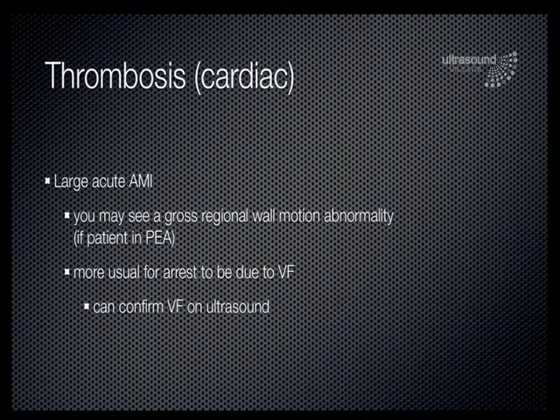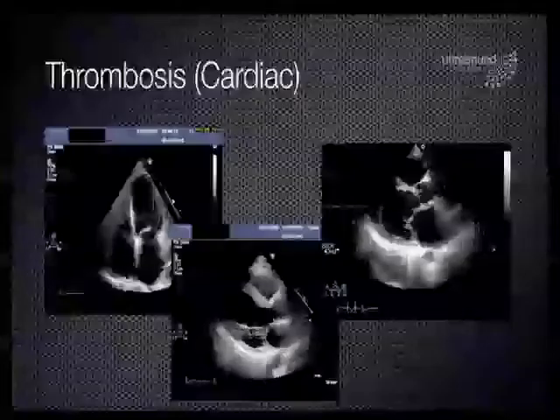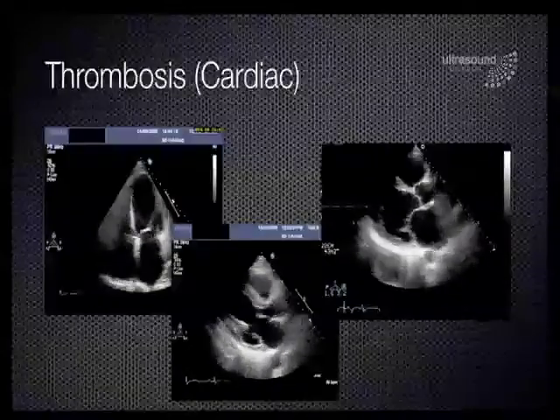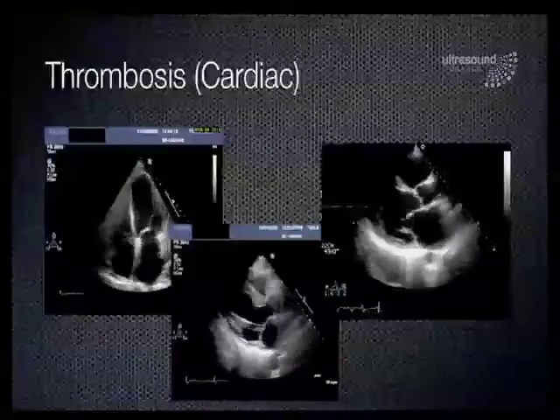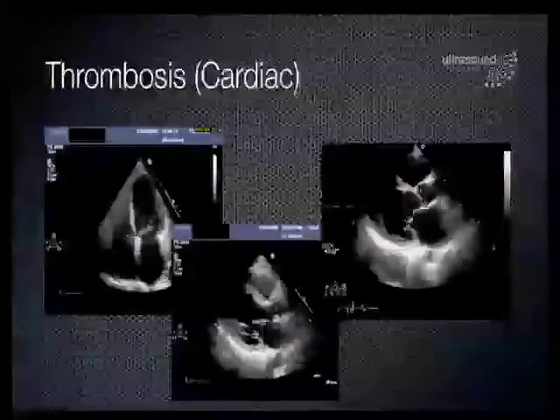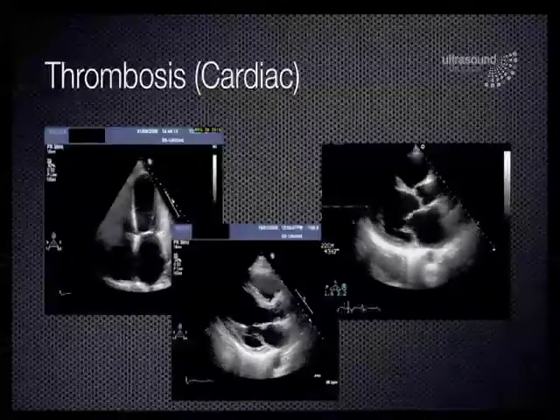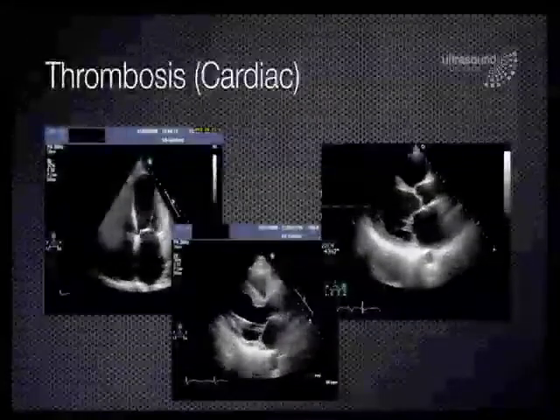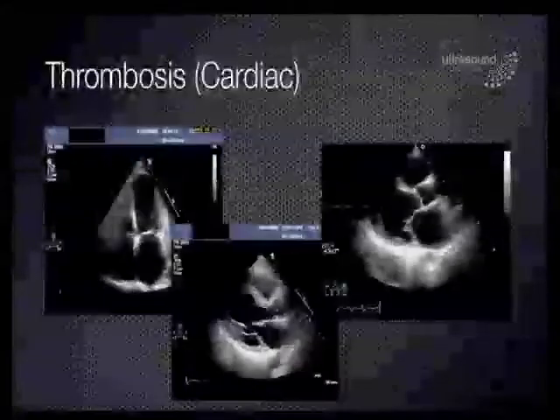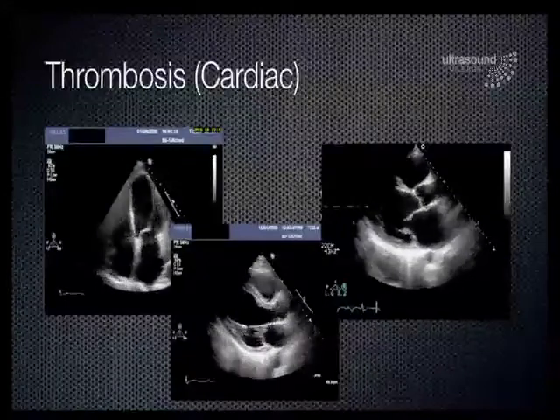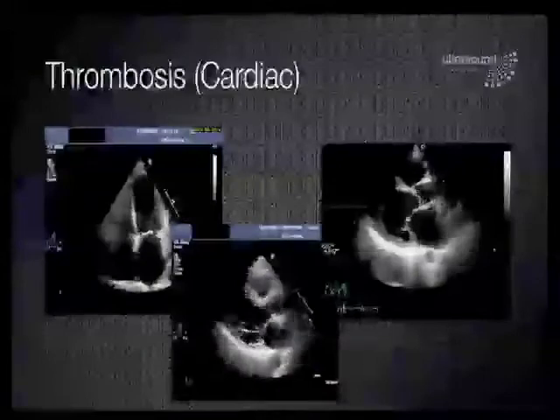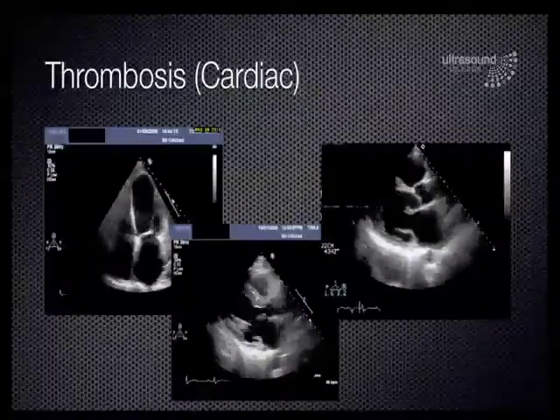In these patients, arrest is more usual to be in VF. These examples are of patients with different regional wall motion abnormalities. From left: an anterior and anteroseptal myocardial infarction; in the middle, inferolateral infarction — you can see the septal wall on the parasternal long axis is thickening whereas the inferior wall is not; and the case at right is an ischemic cardiomyopathy where nothing's really working particularly well.